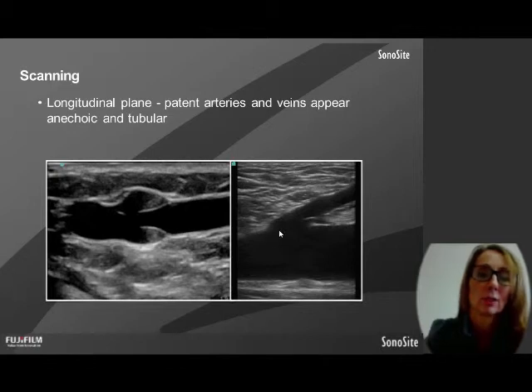So the longitudinal, even if you're going to do a transverse insertion, look longitudinally and make sure that if you puncture here, can you thread? And you probably can't, so pick your sites better.